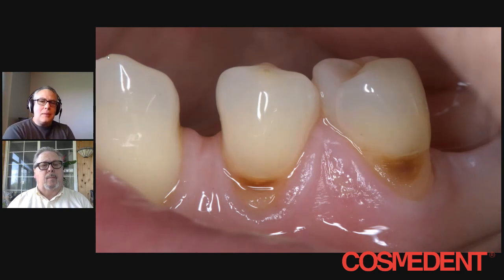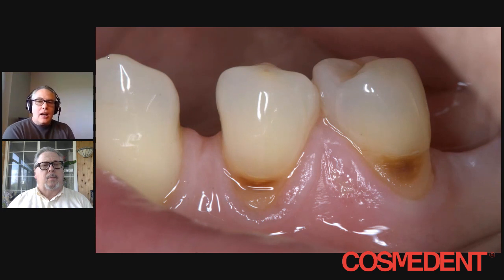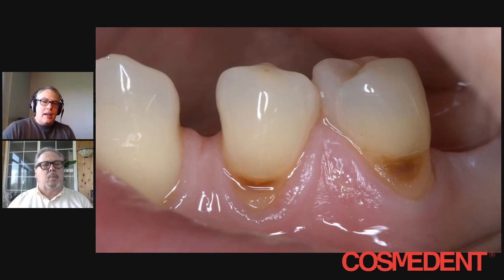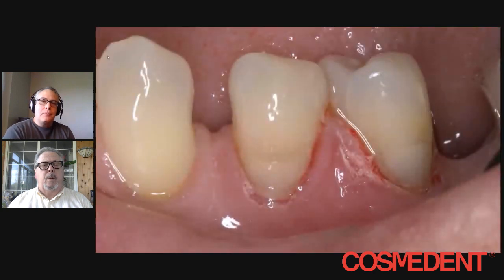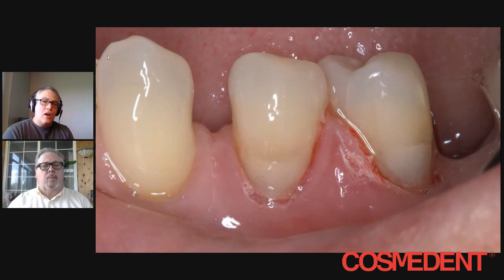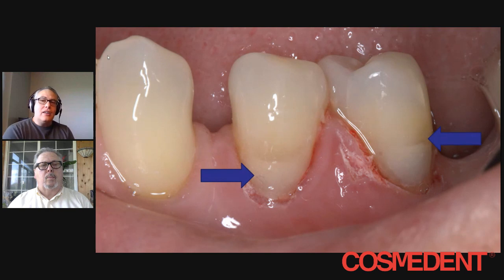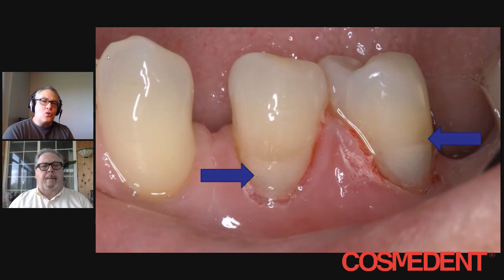However, issues sometimes arise. I've had this many times — this is a case that I've done, and you can see some of the problems. The patient comes in with some sensitivity, so we're going to do direct composite on them. Here's what the patient looked like when they came in, and this is the immediate post-op. Right away you can see two things that are by far the biggest issues with cervical restorations: obvious transition zones and a very gray look to the cervical area.